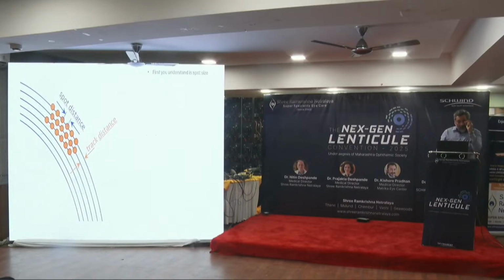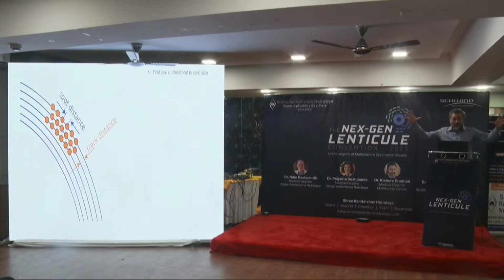So first thing you understand is the spot size. This is going to be quite a long talk. If you get bored, just let me know, I'll speed up. But what you have to understand about a spot size is back in 2006-07, Zeiss started off firing the femtosecond laser. It's like an atom bomb. So the femto is very close to the YAG. You do YAG capsulotomy with cataract surgery, something like that. You put a bomb.